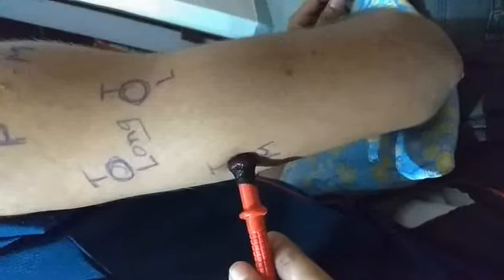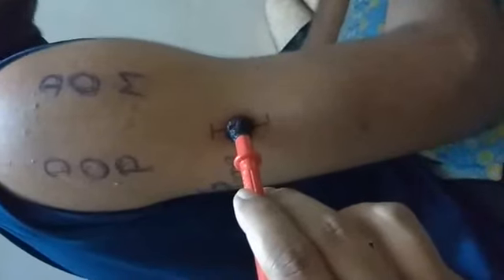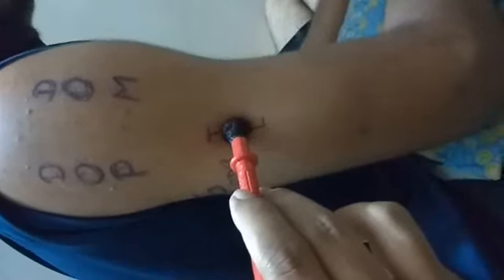This is the contraction for the long head of triceps brachii. This is the contraction for the medial head of triceps brachii. This is the motor point for the long head of triceps brachii. This is the contraction for the lateral head of triceps brachii. This is the motor point of the lateral head of triceps brachii. Done. For the axillary nerve, radial nerve, and musculocutaneous nerve of the arm, the reference electrode we can place at the C7 cervical spine.